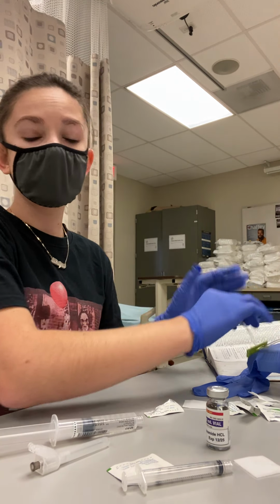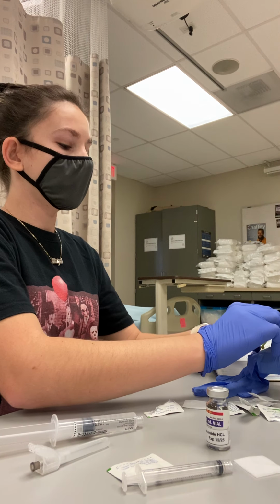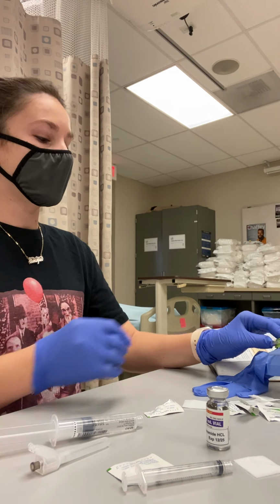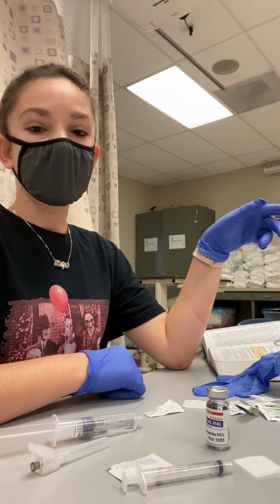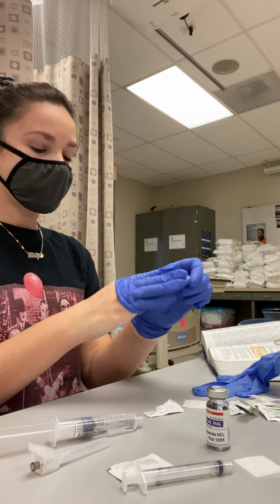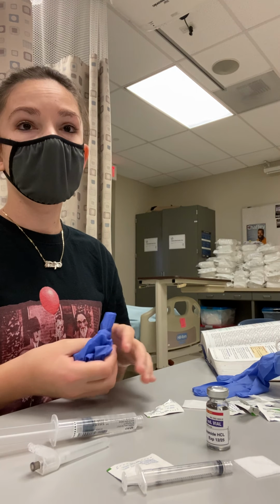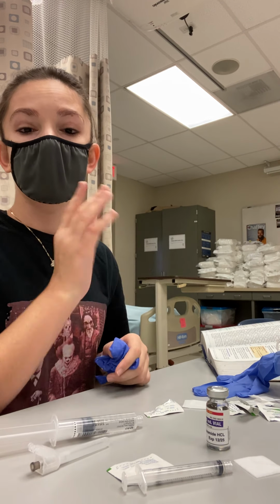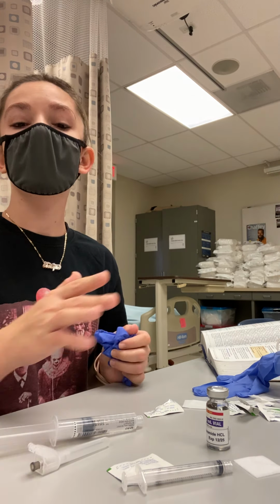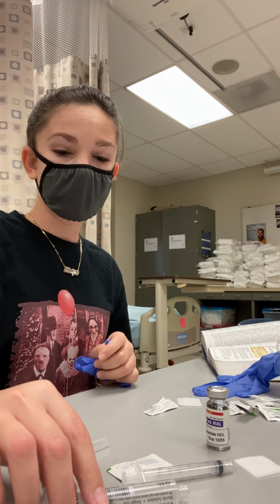Then you will attach to the IV if there's a fluid running. You're going to unclamp, and you will start the IV. And then you will have done vital signs before the administering of the medication, 15 minutes before you give the medication, and then you will do another set of vital signs 15 minutes after the medication is administered.